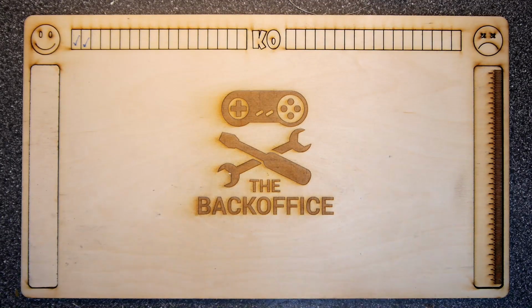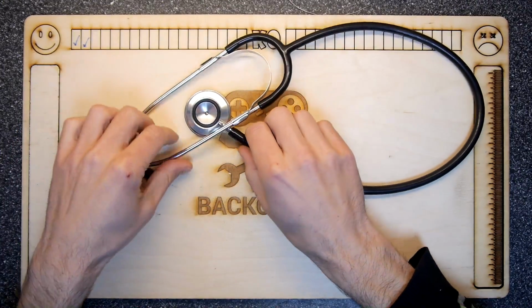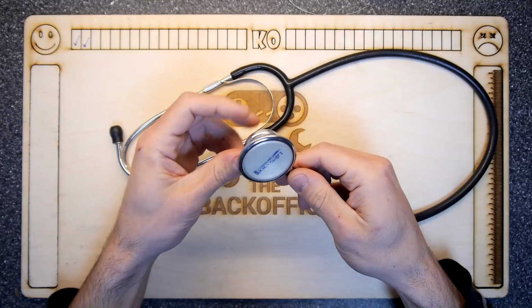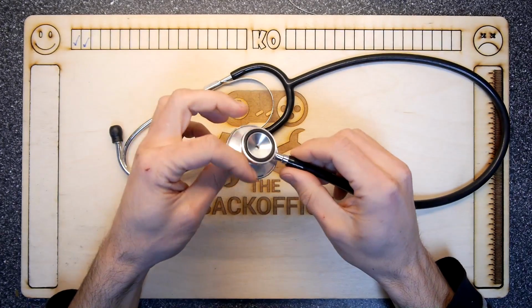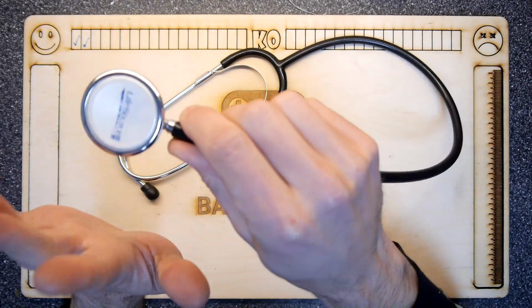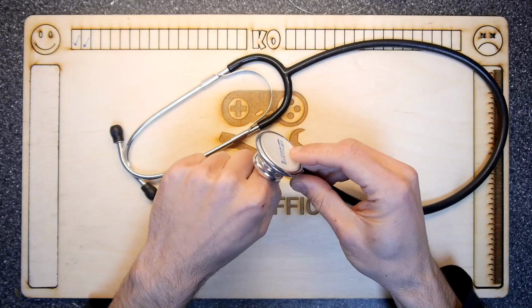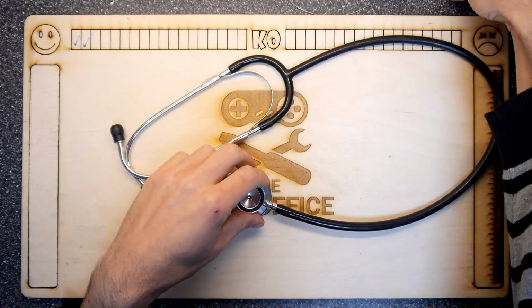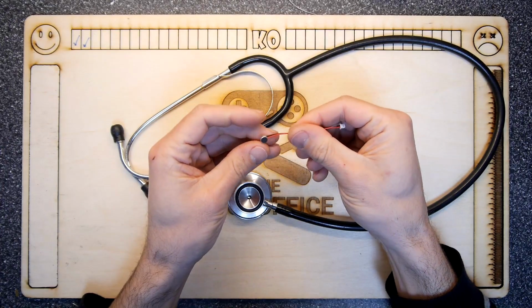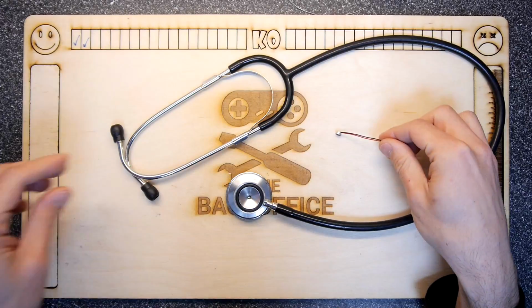So if you're planning to build your own digital stethoscope, you will need one regular stethoscope. I suggest get one on eBay, they're pretty cheap. You'll probably get one for under £20, I should think. This one actually has two doohickeys, so you can listen on this flat drum skin type side or this little high frequency, I guess, smaller end. You'll also need a condenser microphone. In fact, you'll probably need two if you want to do stereo, but one will be enough, I should think.